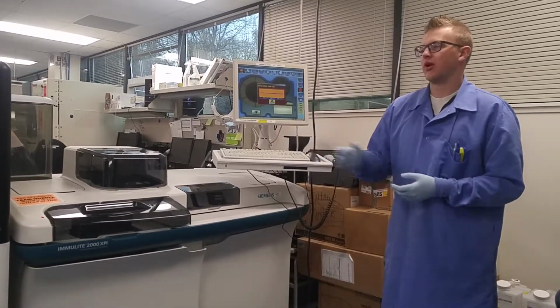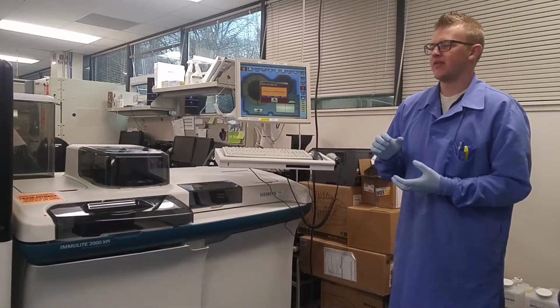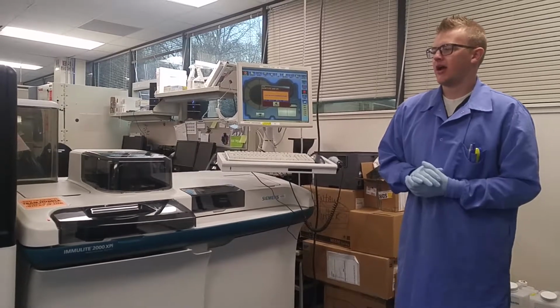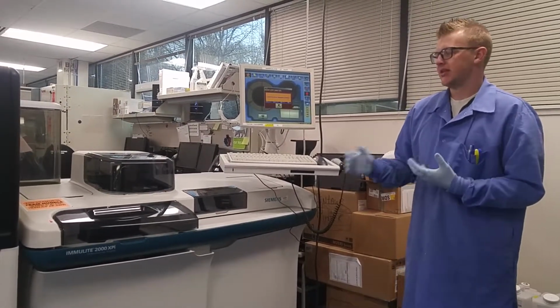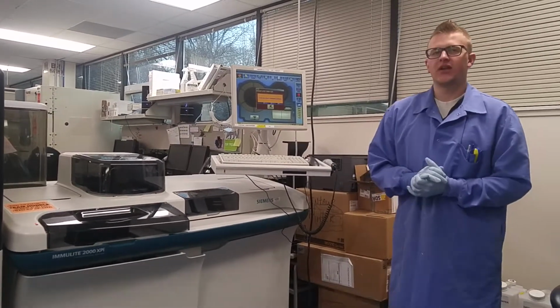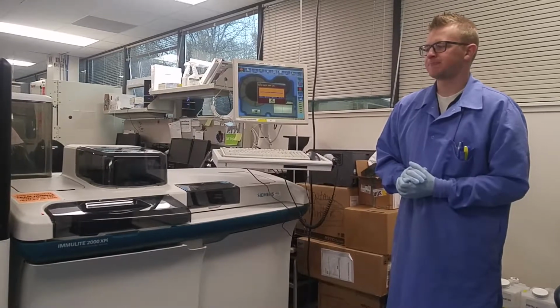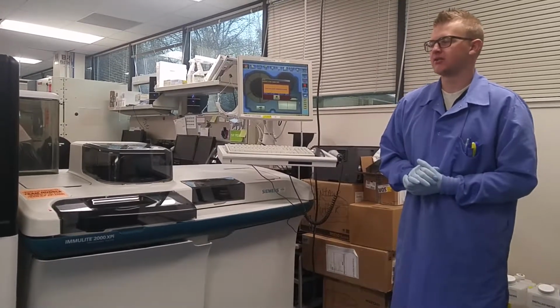And then we're going to run one set of controls just to verify that nothing is going to interfere with patient testing. In this case, we're going to use our adrenocorticotropic hormone levels 1, 2, and 3. We chose this QC specifically because it has to pipette twice, so it's the most involved as far as the pipetting process goes.